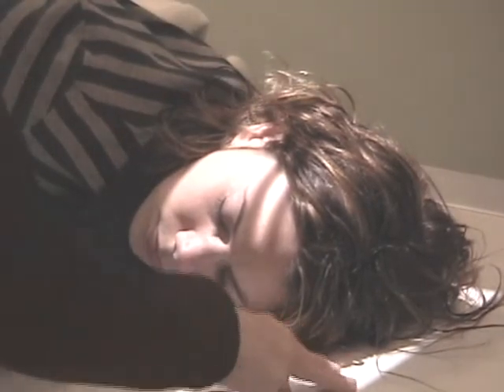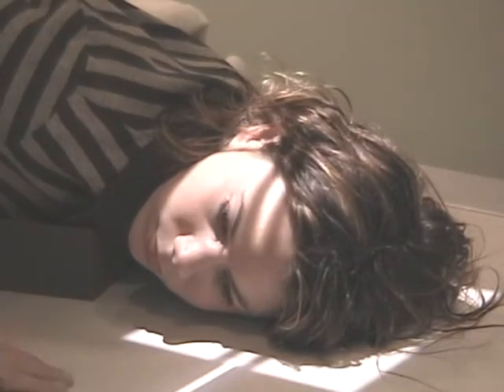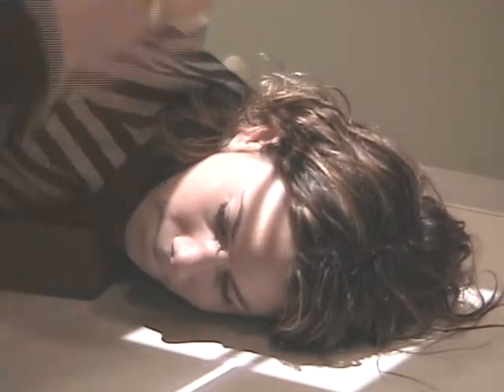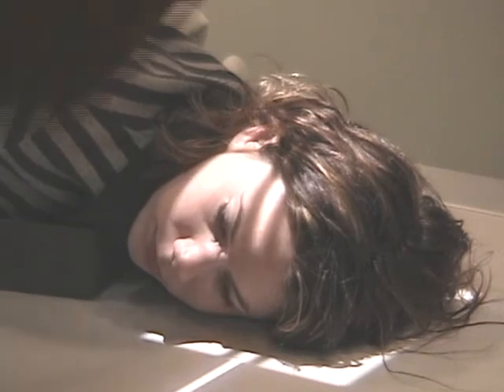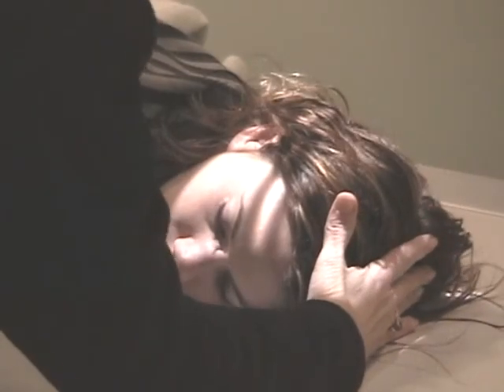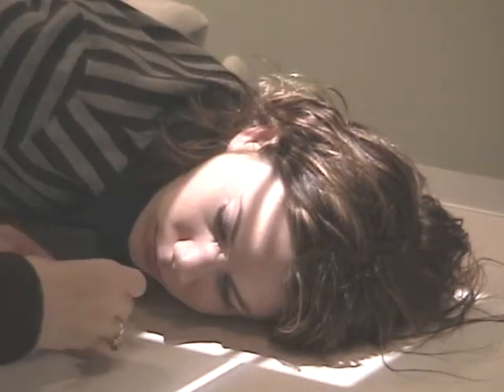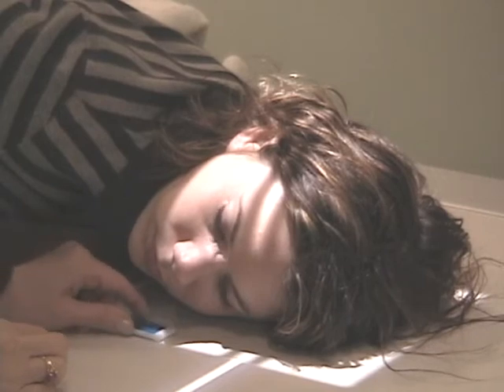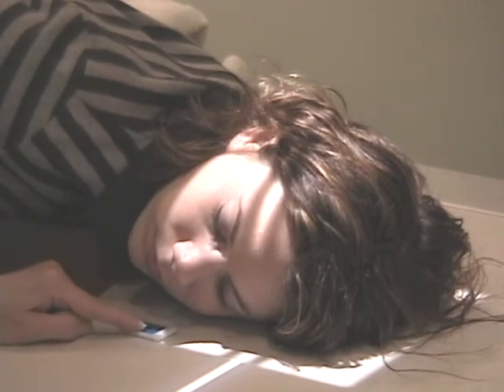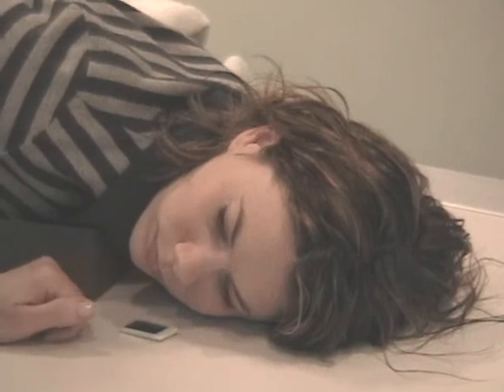My collimation, I've changed the shape of the collimation because it's a manual collimator. It's 10 by 12 crosswise, and I'm making sure that I'm clearing the skull. I have plenty of clearance so I can actually collimate in a little tighter because her skull is fairly small. Making sure I have some light clearing the vertex. And then I put my left marker down over the mandibular area. I'm not putting it all the way into the light source, but at least 3/4 of it will show up there. Okay? And that's a lateral projection.